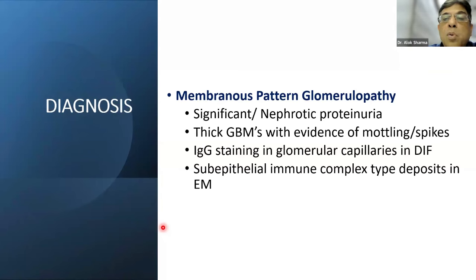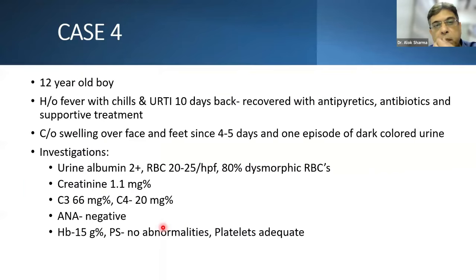So you don't need an EM to make a diagnosis of membranous pattern GN. You can make your diagnosis very well based on light microscopic and immunofluorescence findings. Okay. So that's one other pattern. The next two patterns are almost similar, but I'll tell you the differences as we go along.